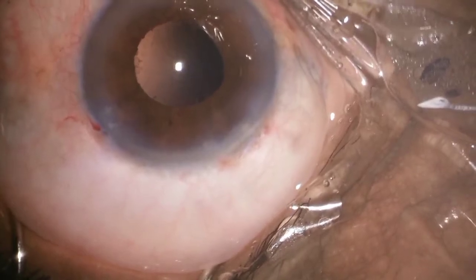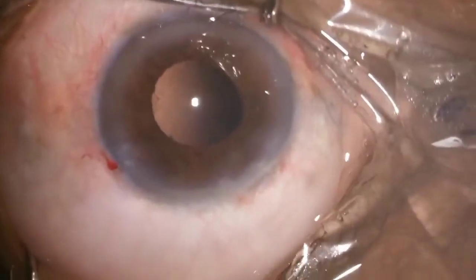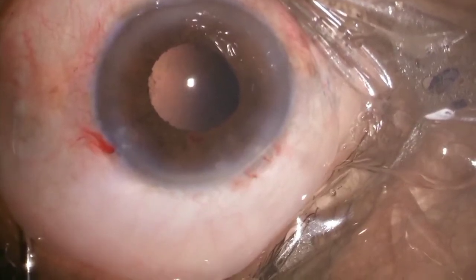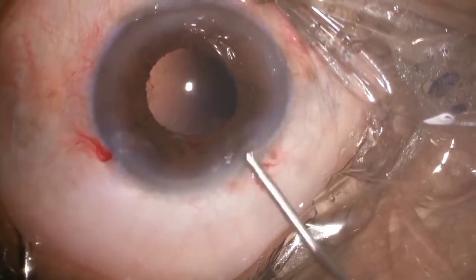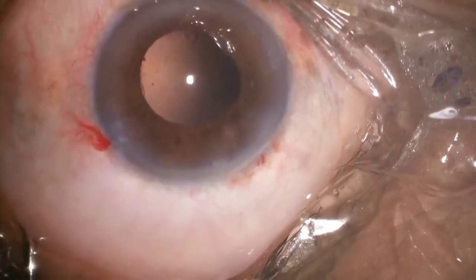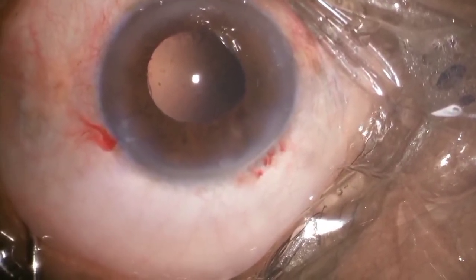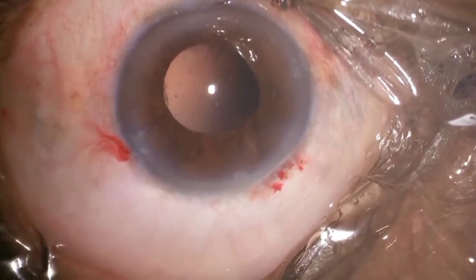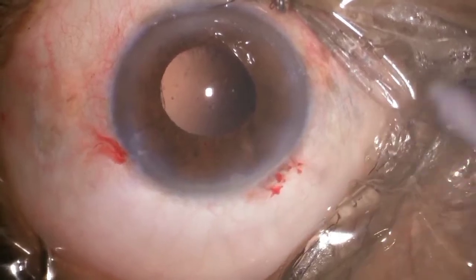Since it was a brown cataract, I was not hoping any cortex should be present here. But then again, I decided to go for irrigation aspiration to verify whether there is a cortex or not.